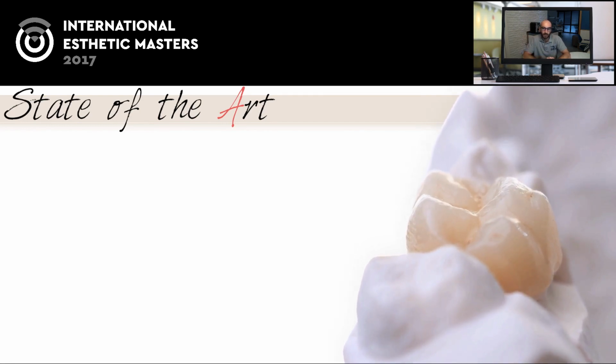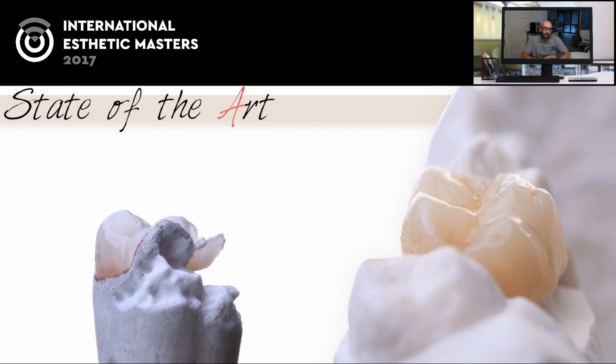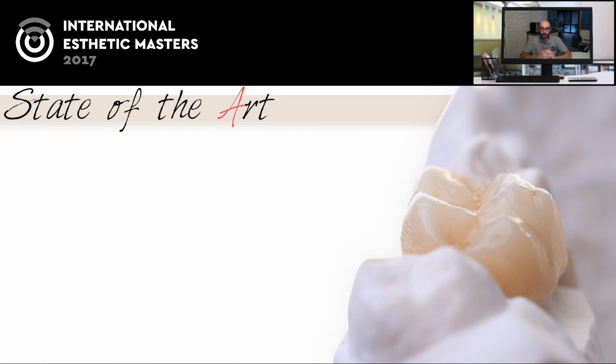And it's funny because just a few years ago, I think it was impossible to say something like that, because this crown is made by CAD-CAM and this crown is made by zirconia full contour. Before this material, what we had in our hand to make a beautiful aesthetic restoration was something like that. The state of the art was the feldspar ceramic over refractory die. But today we can reach more or less the same aesthetic result with more strength with this new material. So that means that our work has completely changed, because the material has completely changed in the last years.